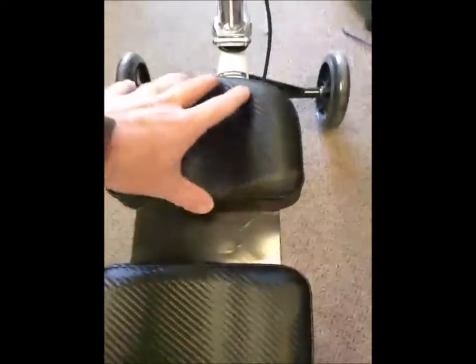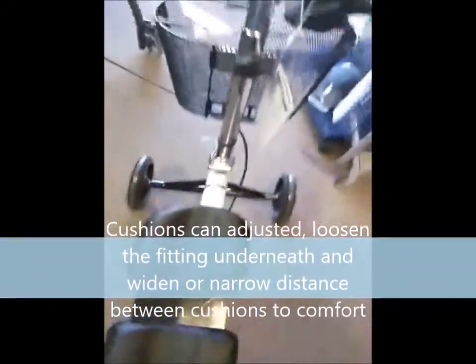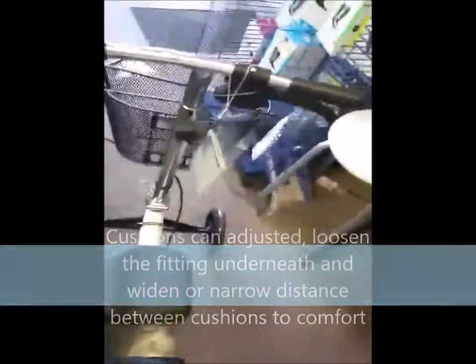The top of the knee scooter has separate cushions. Right here is where you would put the head of your boot, or if you have a pump you'd want to put that right there so you don't have pressure on your shin the entire time.